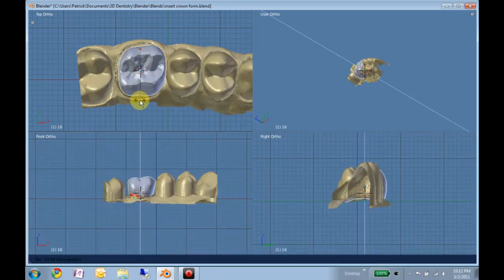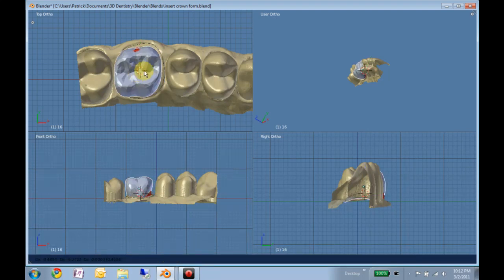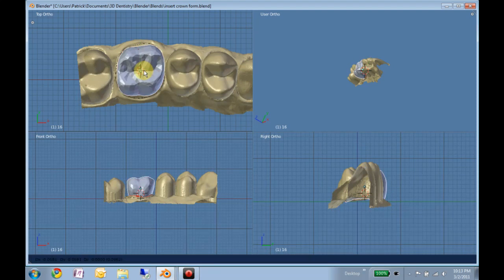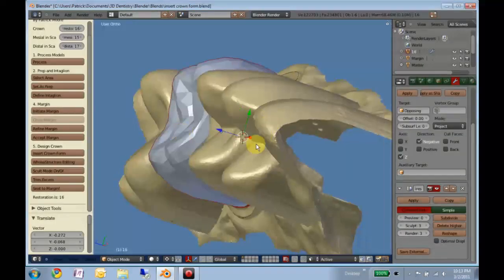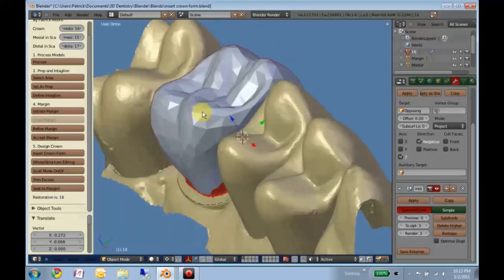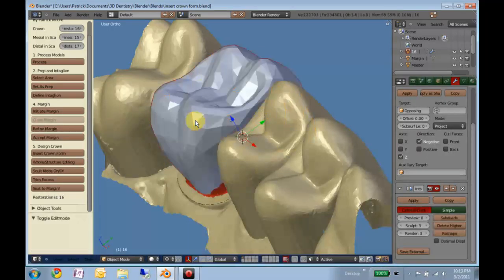You may notice that the crown looks pretty bad. You may be thinking, ugh, that is not good. But do not despair. What you're looking at here is really a substructure; this rough mesh is controlling a much finer mesh, which is what will actually get produced.